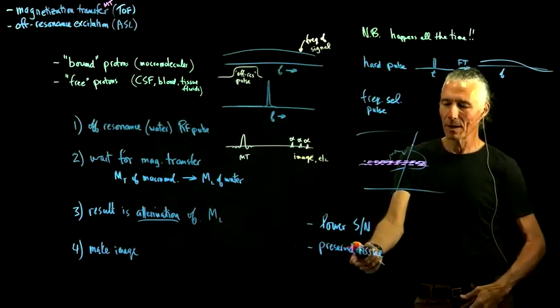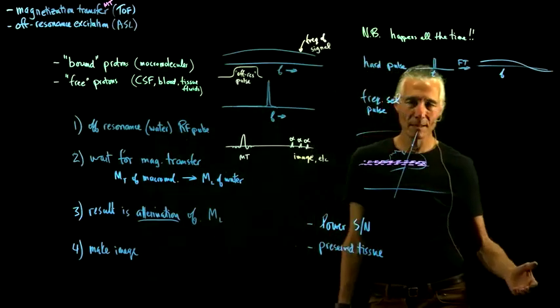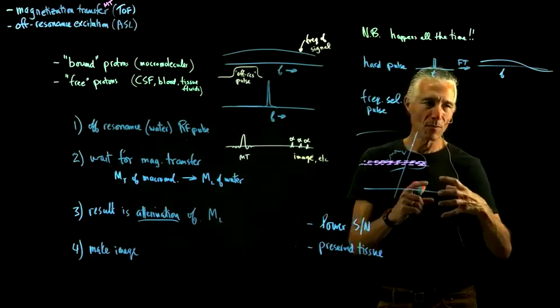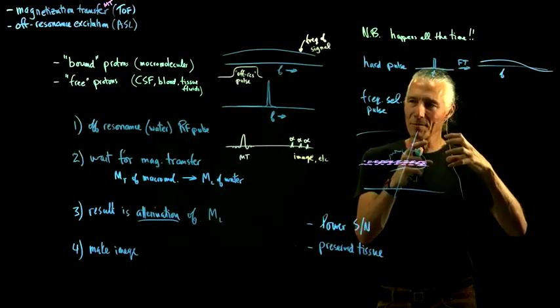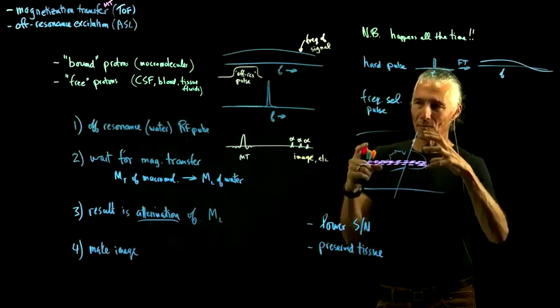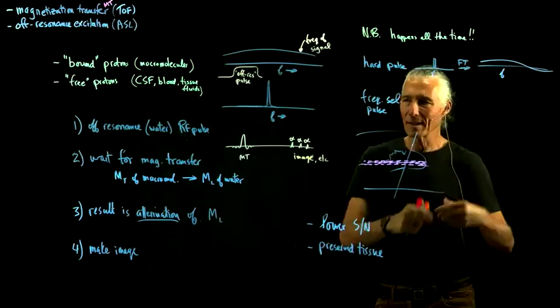And so there's a lot of work on preserved tissue. You might even want to do this even if you're intending to section the brain, because it's not distorted. So you can even scan it entirely in the head. It's slightly gross, but you can put a whole head in there and scan it before anything is changed, before you take it out. And then you have a model of what it's supposed to look like, and then you section it up, and then you can stretch all the distorted sections back into alignment.